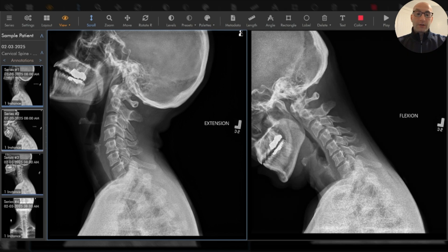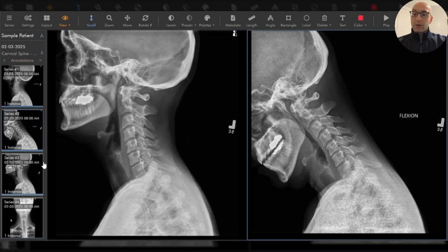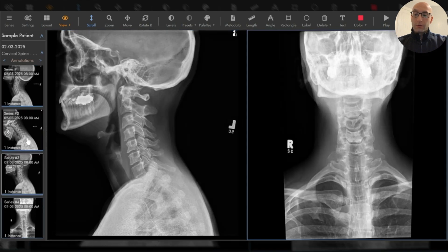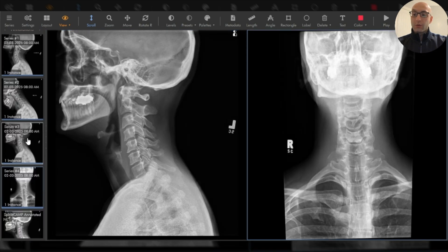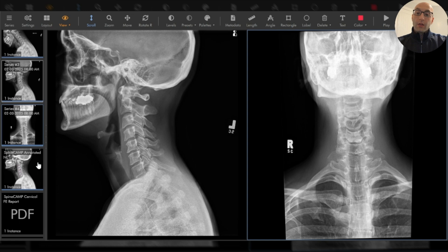So we uploaded an extension image, a flexion image, a neutral lateral image, and a neutral AP image. There was no additional input required. The AI fully analyzed this and provides automated measures of spinal alignment and motion.